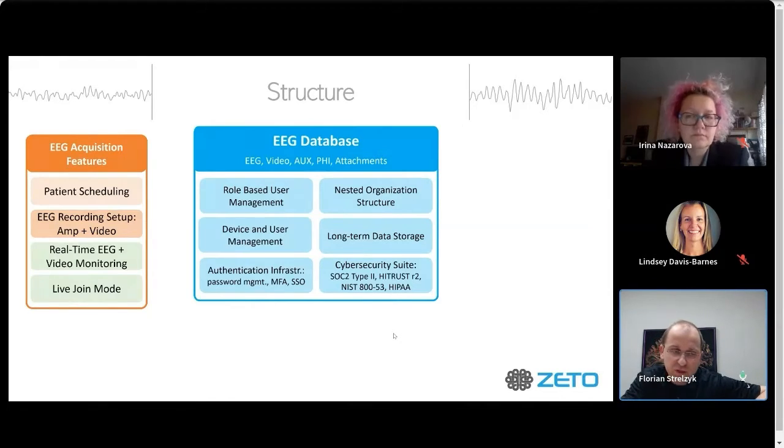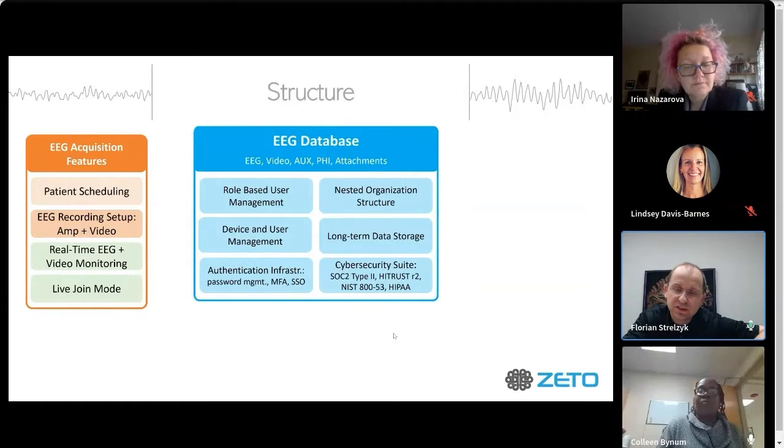We're in over 200 clinical sites at the moment, many of which are hospitals. So we went through several IT reviews, some of them take 6 to 8 months, in-depth reviews with IT teams. We're at the VA. We're at some of the largest hospital centers in the nation. So rest assured your data is secure, and you wouldn't be the first one using it.